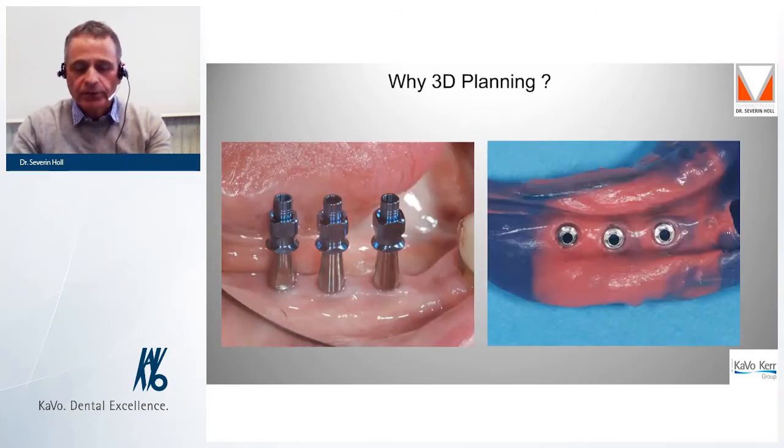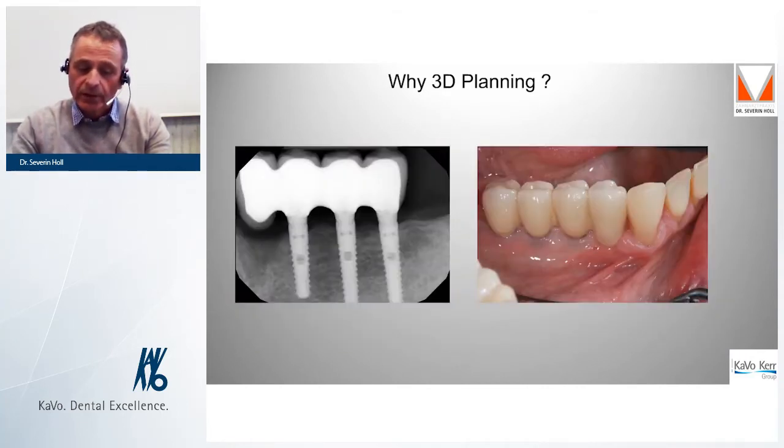A few more pictures to the prosthetic. The impression is taken with the Legacy abutments in which we fixed the longer screws so they can be removed more easily. On the right side you see the impression with polyether. And here is the final restoration with the ceramic finished bridge, the X-ray and the cemented bridge on the abutments.